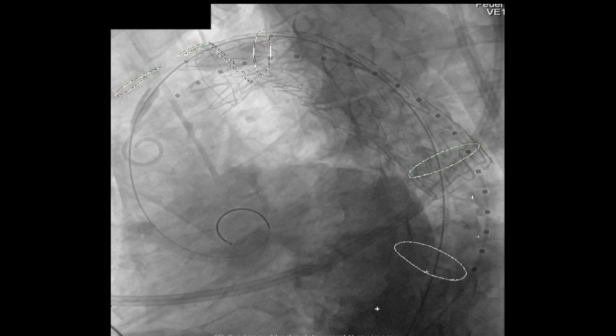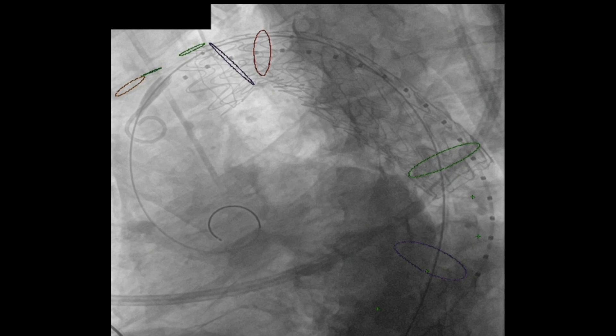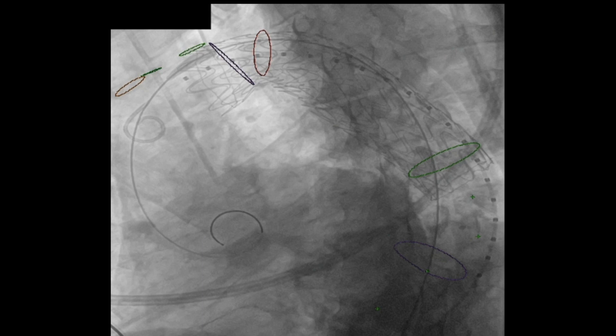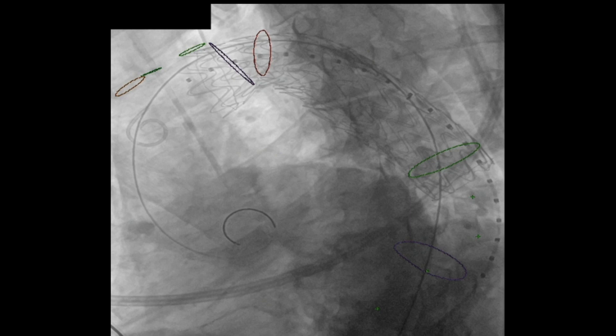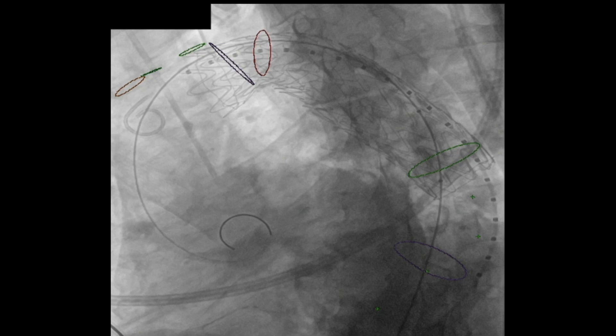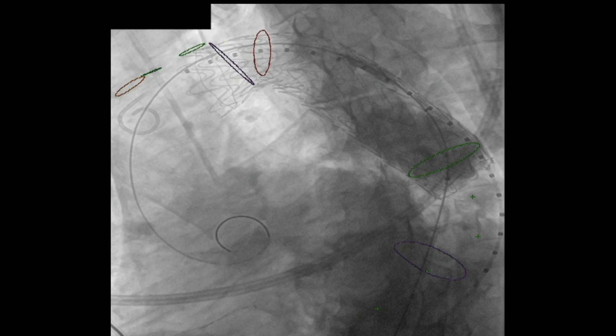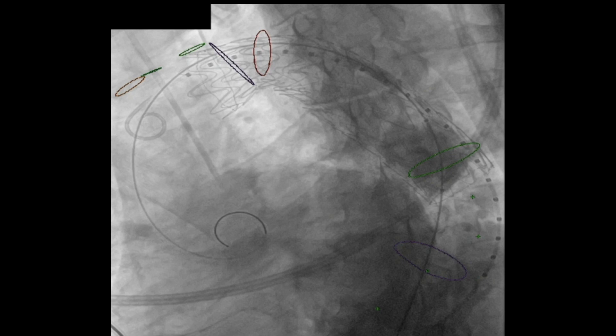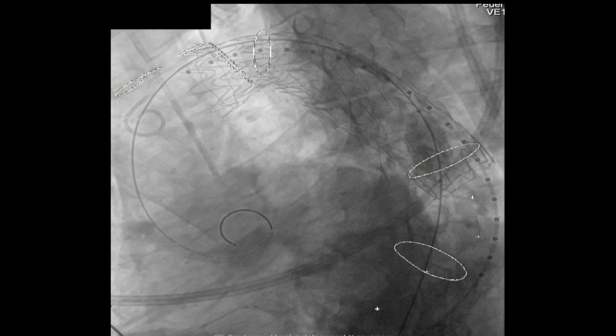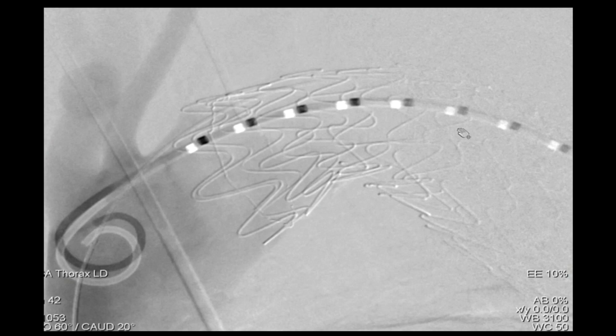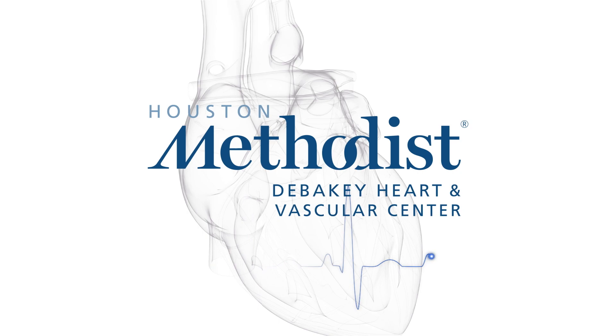Here's what it looks like in place. The pigtail catheter has been brought up and we're going to go ahead and do the injection, demonstrating after ballooning the proximal and distal area of the stent graft that the aneurysm has been successfully excluded. We're completing the ballooning, removing the balloon catheter, and ballooning the distal attachment site, followed by a completion angiogram using a 20cc injection. This avoids having to give a lot of dye preoperatively — the fusion allows us to minimize the amount of intraoperative dye. This concludes the demonstration of how a ferumoxytol MRA can be used to fuse and guide deployment of a thoracic stent graft.